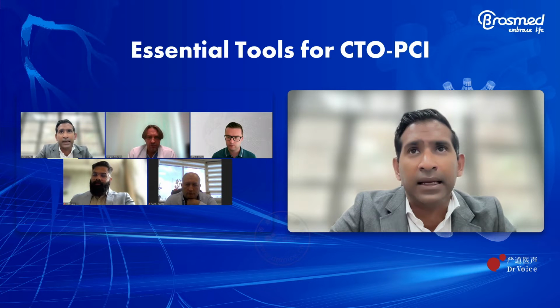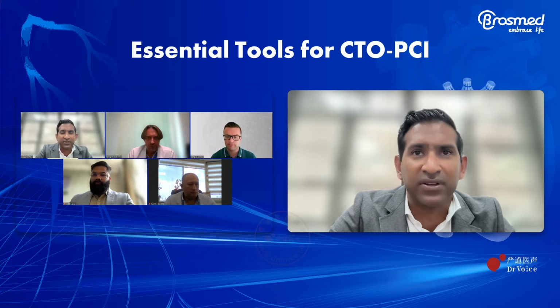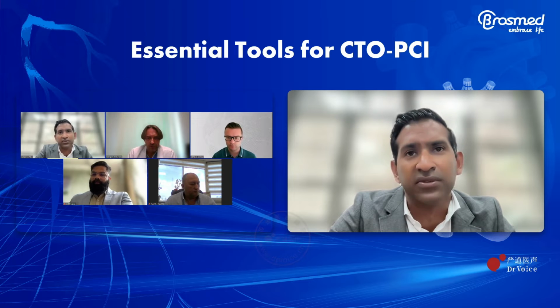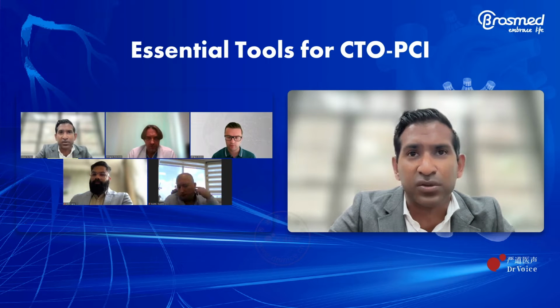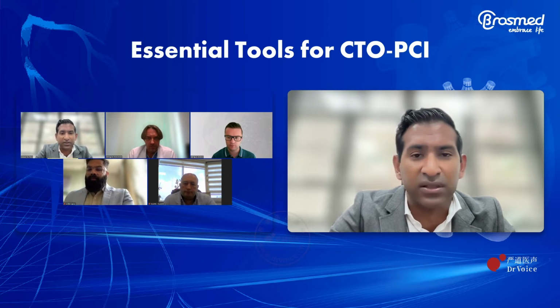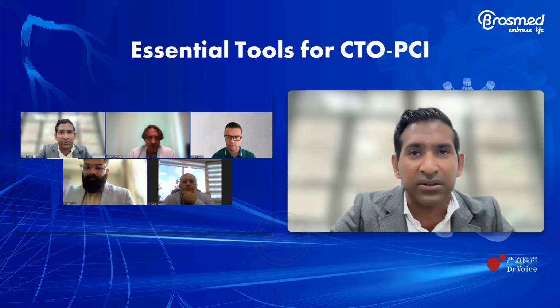It varies depending on experience. I think that's the first thing to say. And it also varies on your ability to switch between different techniques. So if you are only able to work in the antegrade setting versus both antegrade and retrograde, then your success rate is going to be much reduced, and therefore developing skills to allow you to cross between antegrade and retrograde, as shown in the second case by Grzegorz, is really key to increase your options and increase the success rate.